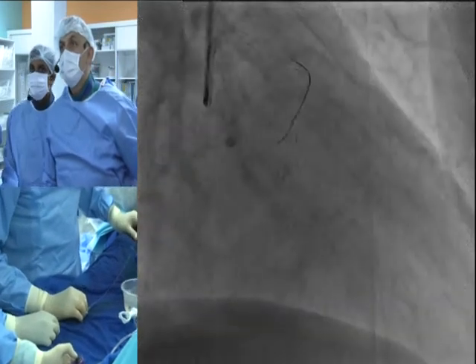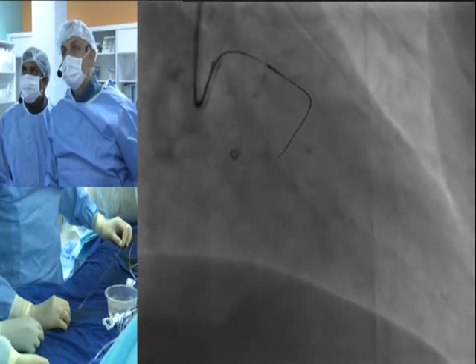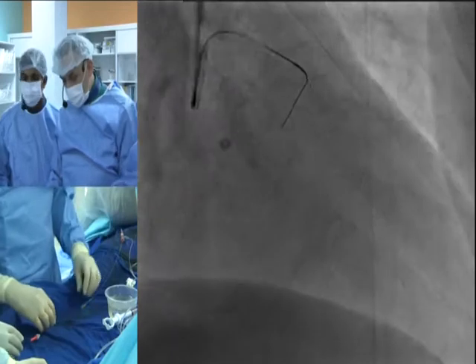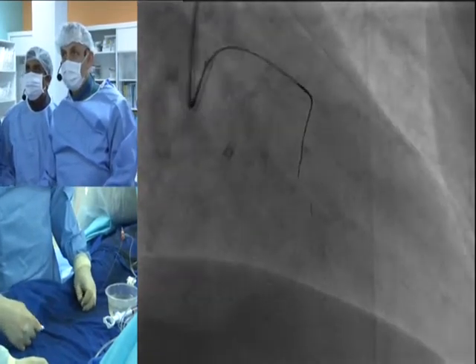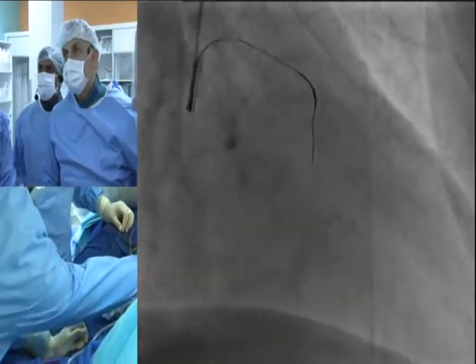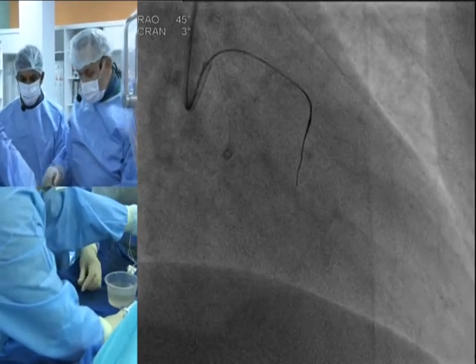So, I would like to introduce this. We want to be in the second branch of that first septal. I will come back a little bit. I think that's the one. So we'd just like to do some tip injection here to see where we are going.